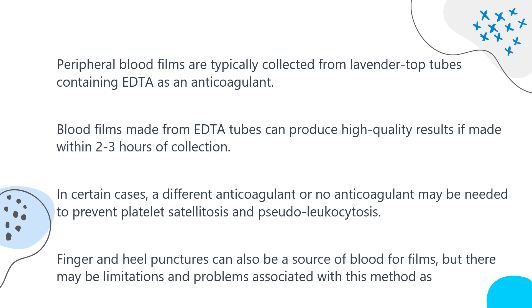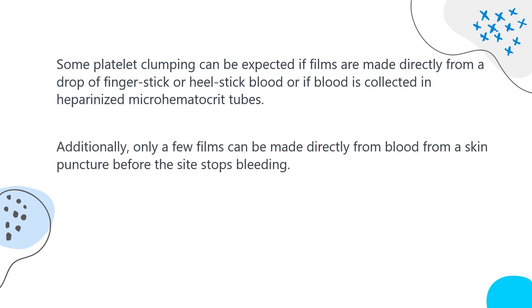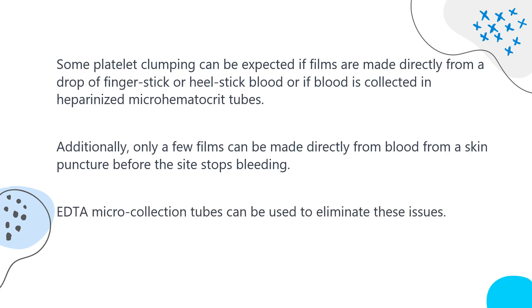Finger and heel punctures can also be a source of blood for films, but there may be limitations, as some platelet clumping can be expected if films are made directly from a fingerstick or heelstick drop of blood, or if blood is collected in heparinized microhematocrit tubes. Additionally, only a few films can be made directly from a skin puncture before the site stops bleeding. However, if slides are made quickly and correctly, cell distribution and morphology should be adequate. EDTA microcollection tubes can be used to eliminate these issues.